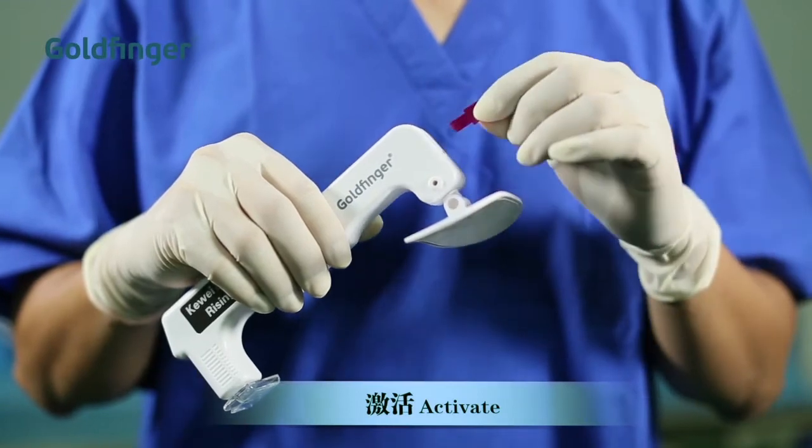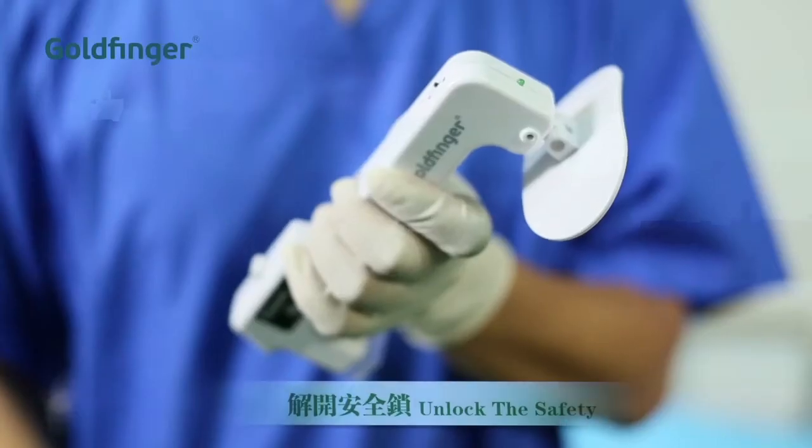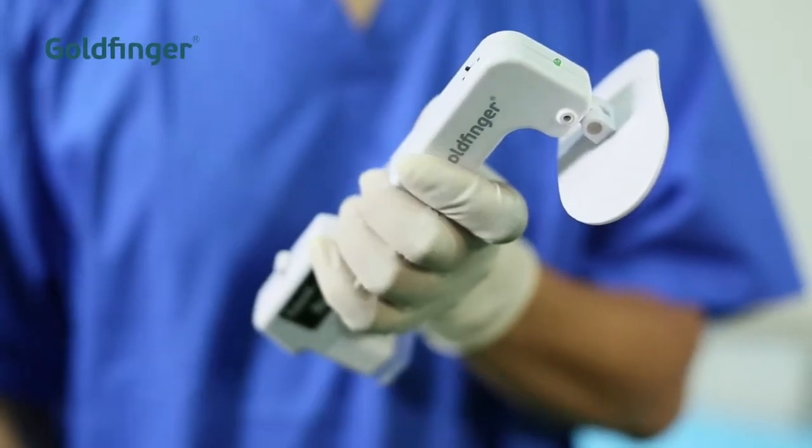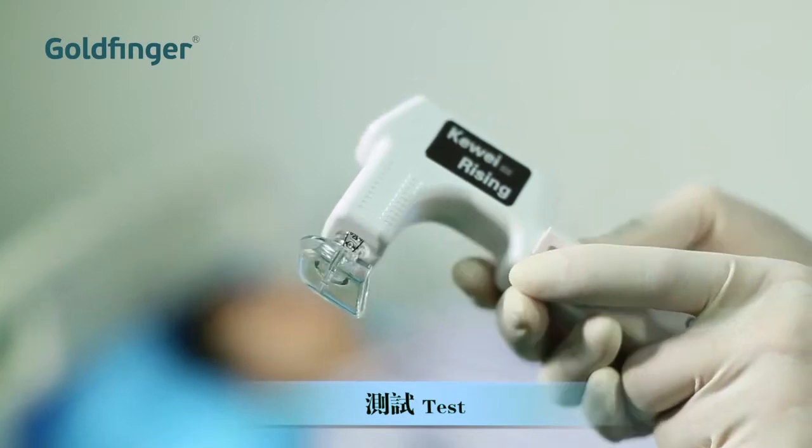Pull out the tag to activate the device. Unlock the safety. Test the device before using.